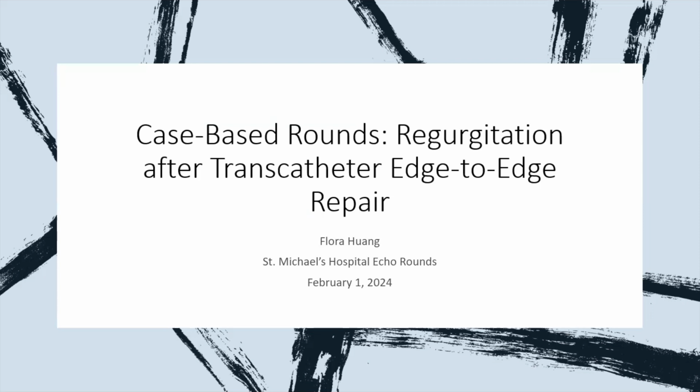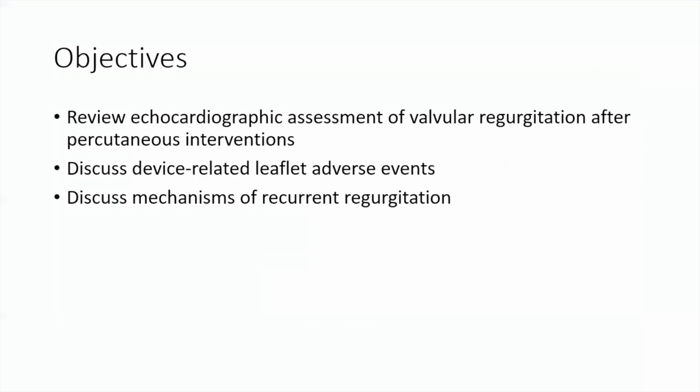So like Dr. Chow said, I wanted to do a case-based rounds based on several of the cases that I've seen that I know the lab sees quite often in terms of assessment of these patients who have transcatheter edge-to-edge repair, especially given the focus of St. Mike's on quite a bit of structural interventions. I think this is a really relevant topic for us.